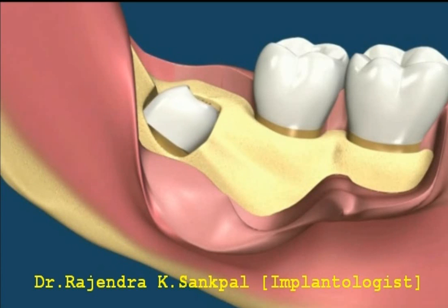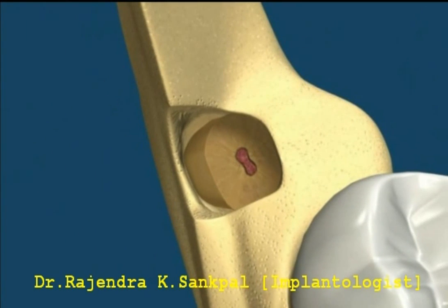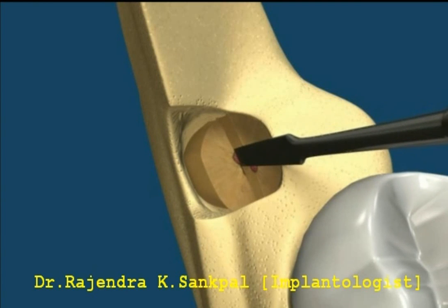Being very careful, the tooth is sectioned again to separate the roots, but not sectioning all the way to the furcation or bottom. The roots are separated with an elevator, breaking the lower portion that was not sectioned. The two roots can now be gently removed, avoiding nerve manipulation.